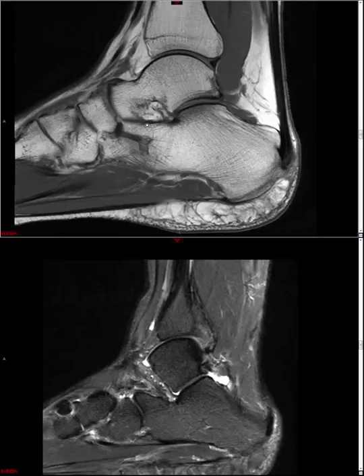Low signal throughout on all sequences suggests a more chronic process; fluid signal throughout suggests a more subacute to acute process. We want to see complete effacement of that sinus tarsi fat before invoking sinus tarsi syndrome.